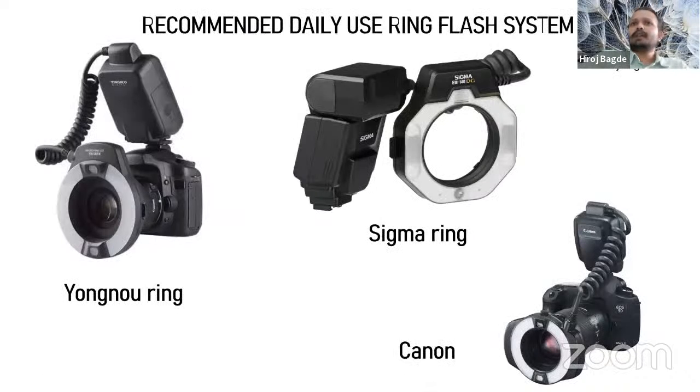Now the third portion is the flash system. I'm going to deal with how this works in detail, but I need to tell you about the different kinds of flash systems which I recommend first. For daily use, for any type of photography, we need light spreading to all corners of the oral cavity, or inside macro photography, to the subject.